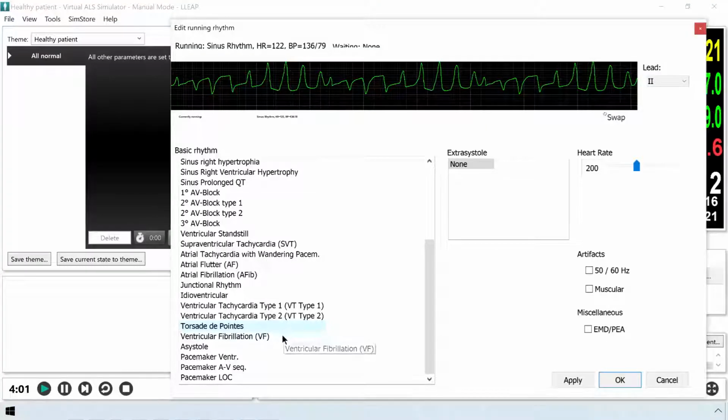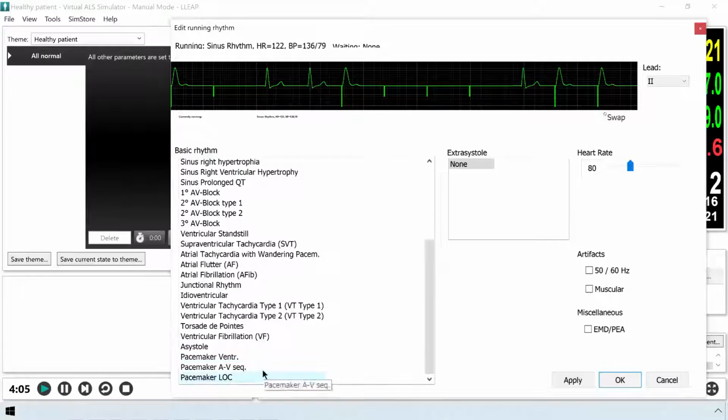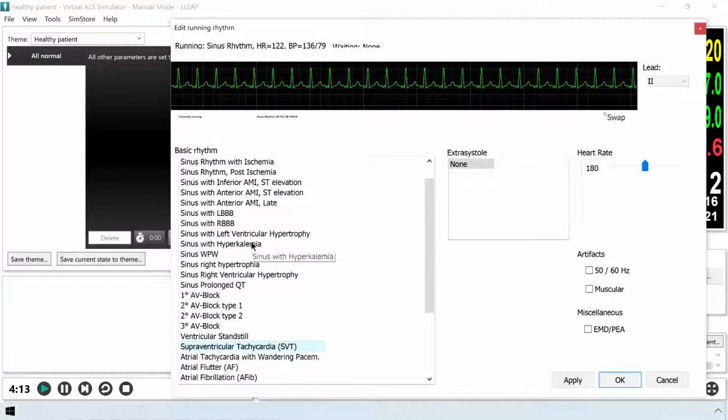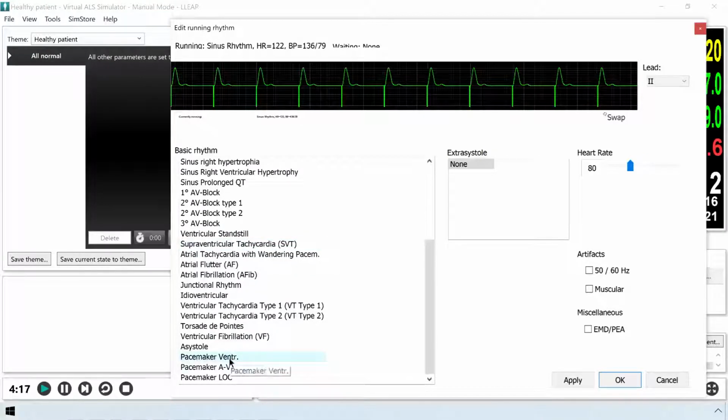I know one of these is supposed to be like Batman. I can't remember which one it is. It's supposed to look like Batman when you work with it. That's not it. It was something with the atrial thingy. Can't remember. It has an A in there somewhere. That much I do know.